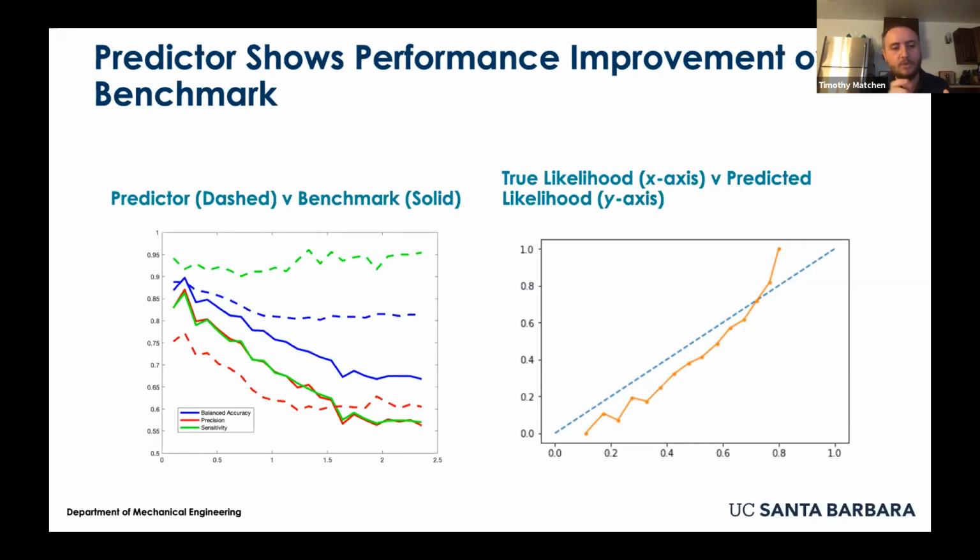But as we increased the time between the two windows that we were looking at, we found that our new model was much more robust to that than these benchmarks that we used, where you started to drift toward essentially random chance.